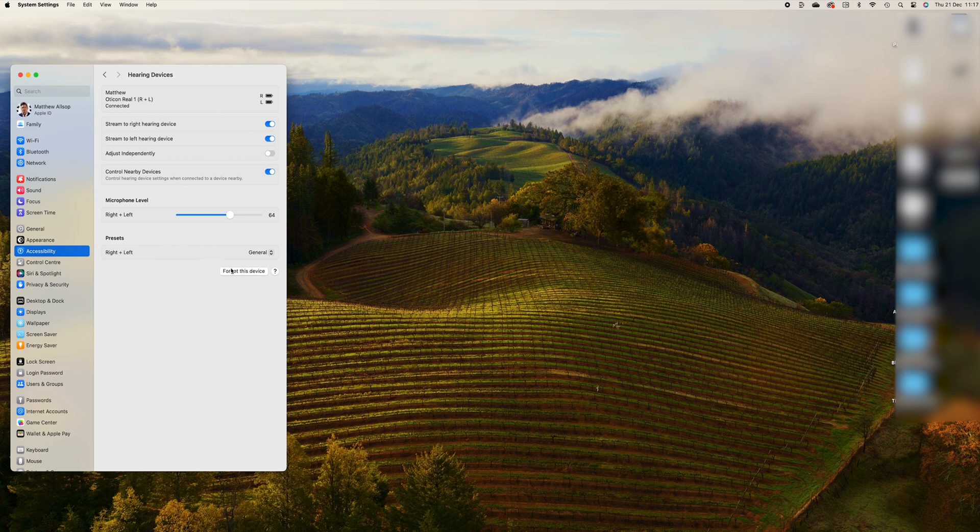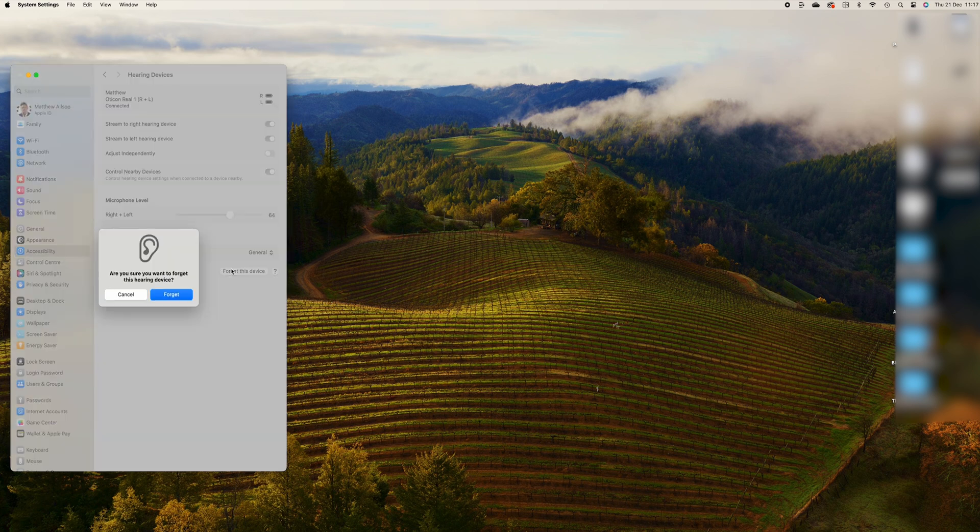Next, click on Forget This Device, and then forget when the box pops up. And that's it. You're disconnected.